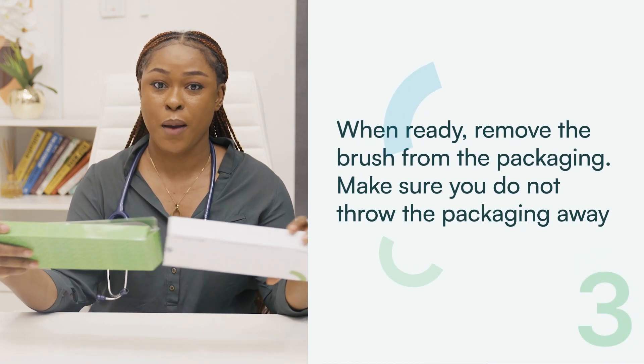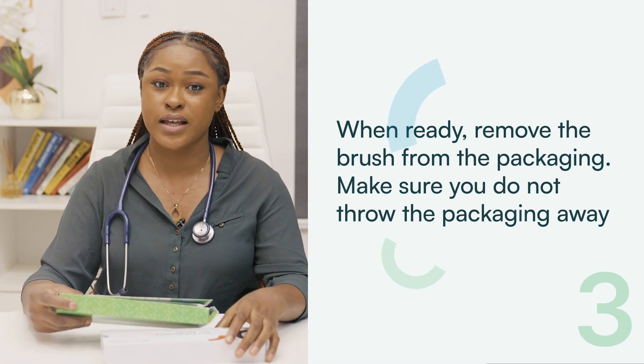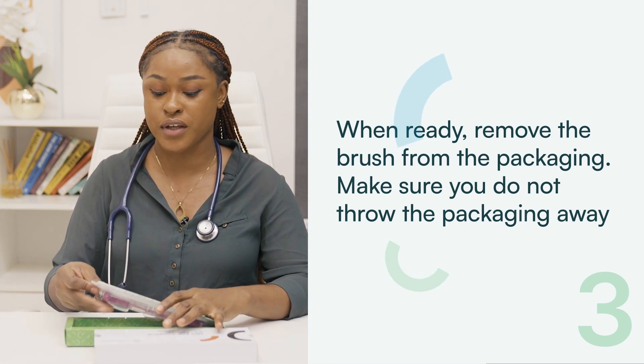Step 3: When ready, remove the brush from the packaging. Make sure you do not discard the packaging as it will be necessary for sending the brush to the laboratory after usage.